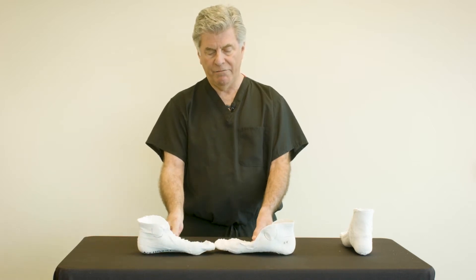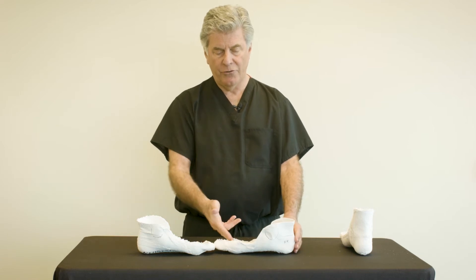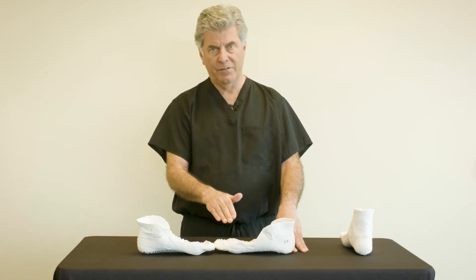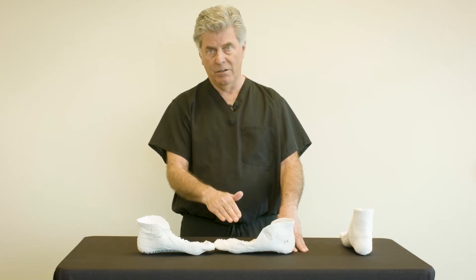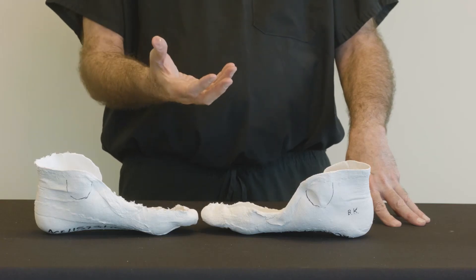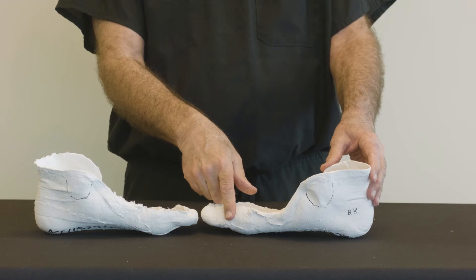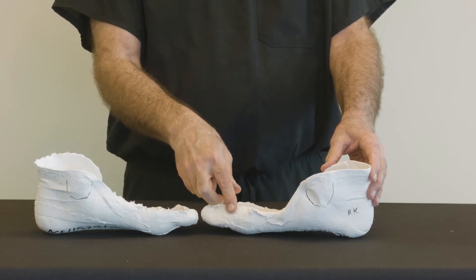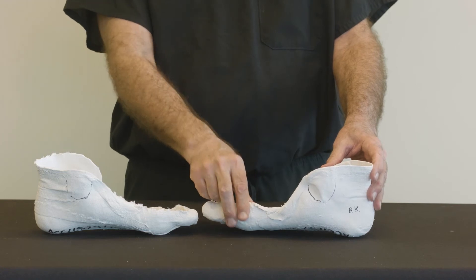Another problem when we fail to reduce supination deformity is the arch is much flatter in this cast, and the brace and the foot orthotic will be flatter. Practitioners will hold this orthotic up to the patient and they will not see good conformity to the arch. It all started with the casting process and the failure to reduce supination deformity.